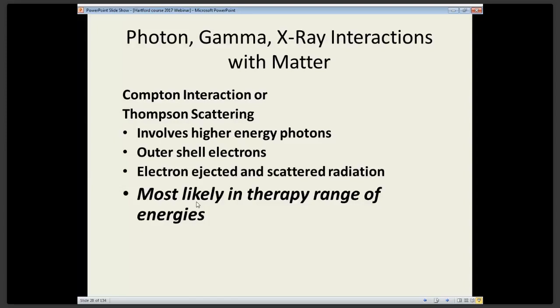When we talk about shielding design for radiation vaults, this is important to remember. We're not that concerned with scatter from the patient. We are concerned about stopping the direct beam of the linear accelerator, and those are those large direct beam barriers that are usually over 6 feet of concrete.